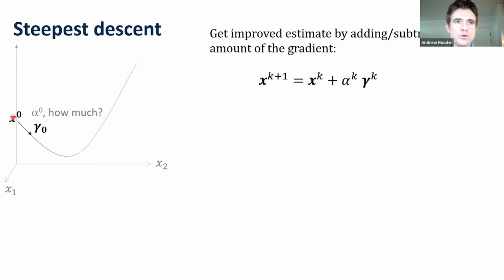And we evaluate the gradient, which would be basically another image. And it's basically, therefore, defining a direction to go in order to minimize this least squares objective function. So I'm just writing that generally as follows. Next update is given by previous update, and in general, I'm going to say plus some scalar step size of the gradient evaluated at the current estimate.